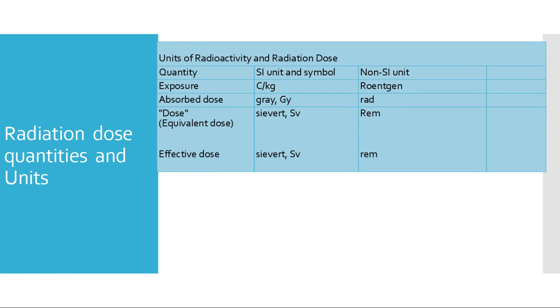The fourth step: you know that the human body has different radiation sensitivity. When I make an X-ray image of the chest, another X-ray of the abdomen, and another of the legs, for example, or of the brain, and the absorbed dose is the same, the effective dose will be different, because the sensitive organs are always at the pelvis, for example, and at the chest, for the female exactly. If a sensitive organ is within the primary field, we can expect a higher effective dose. But if we do a CT scan of the brain, we expect a very low effective dose, even though the absorbed dose is very high.